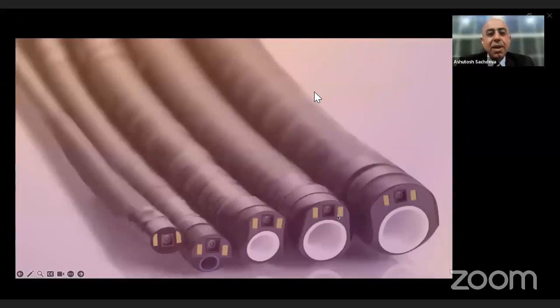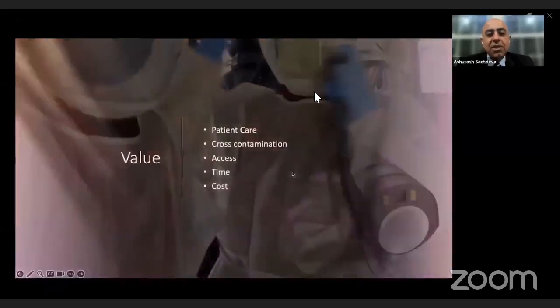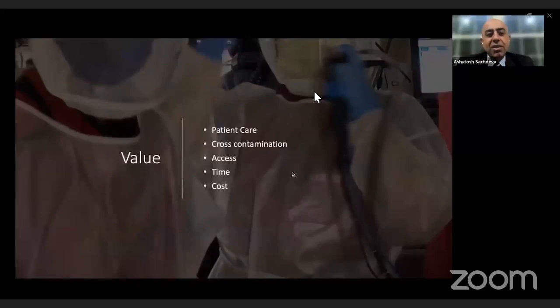And as you progress, a lot of companies are focusing on how they can get the best inner diameter for the least outer diameter. Most scopes that are classified as therapeutic scopes fit somewhere between a 5.6 to 5.8 millimeter outer diameter, ranging up to 6.2. The inner diameter, the working channel or suction channel, is approximately 2.8 to 3.4, and bigger is better, or suction is dependent on how the channel is structured and how the scope is designed.